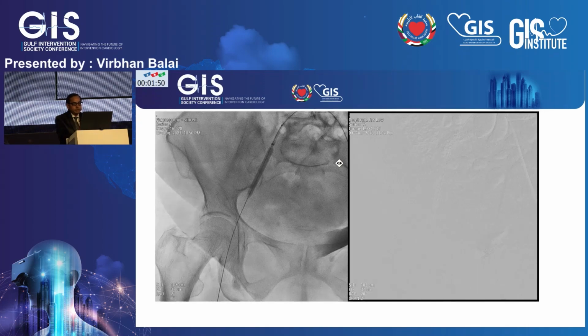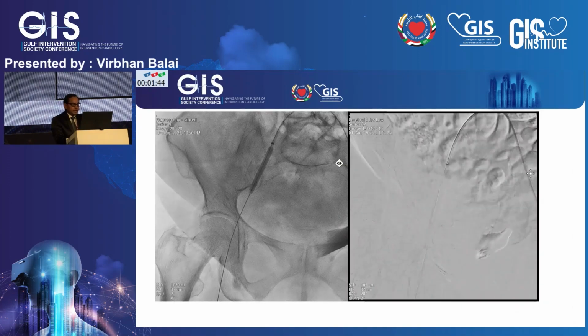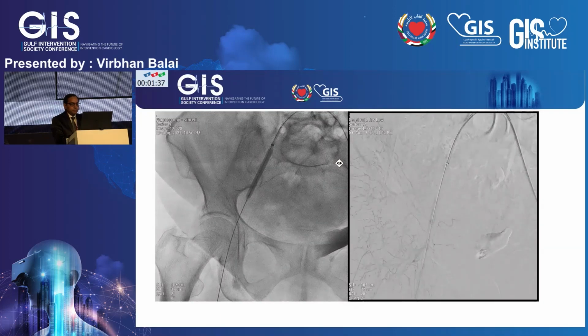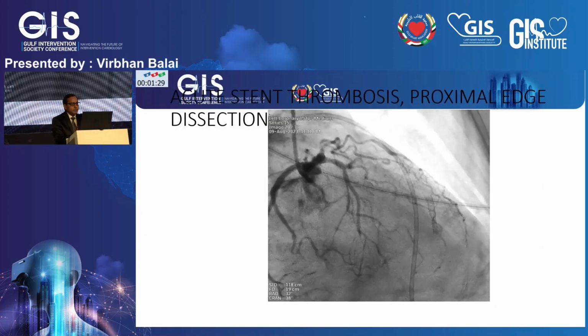Anyhow, the vascular surgeon decided that we should do a balloon tamponade of this right femoral arterial access site. So a 6 by 80 mm balloon tamponade was done at low pressure. But we couldn't achieve much. The only thing is that we created one more dissection distally, but as it was not flow limiting, we decided to manage this as well conservatively only.